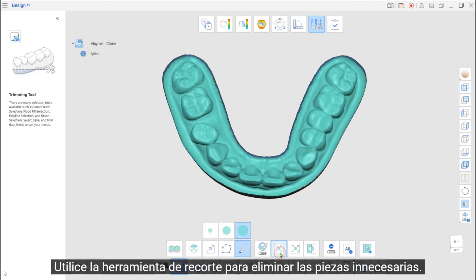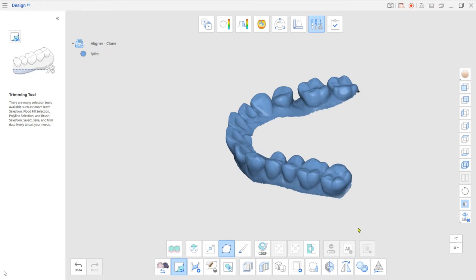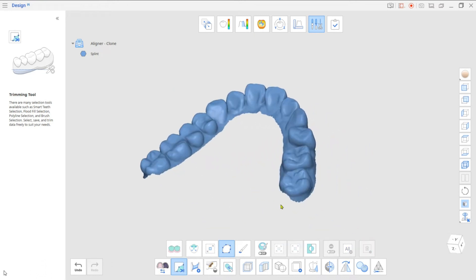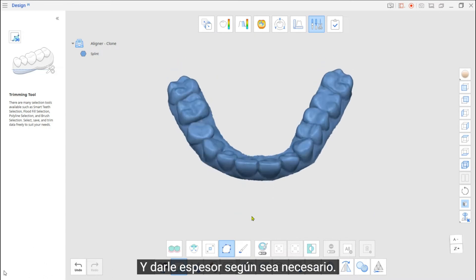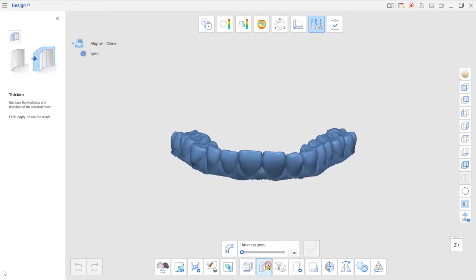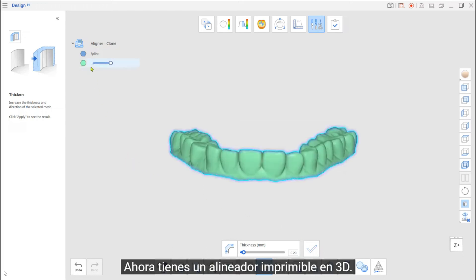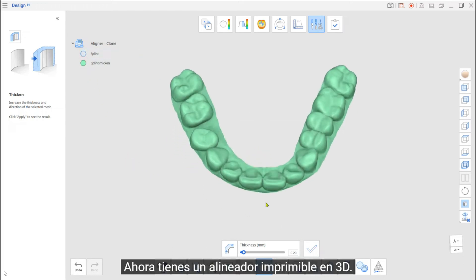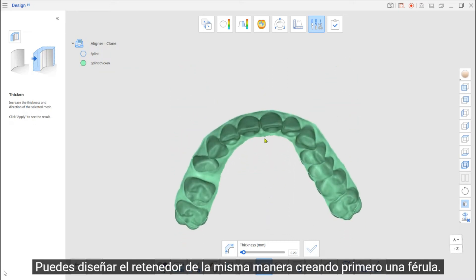Use the Trimming Tool to remove unnecessary parts and give Thickness as needed. Now you have a 3D printable aligner. You can design the Retainer in the same manner by creating a Splint first.